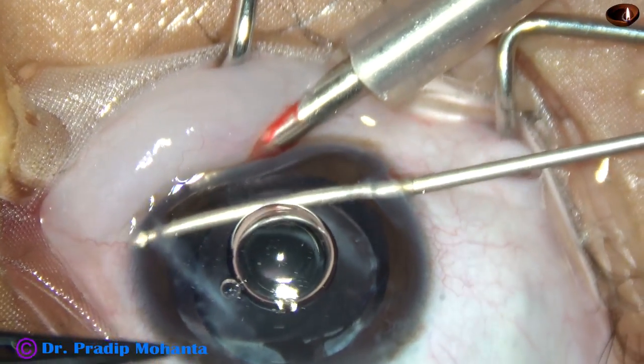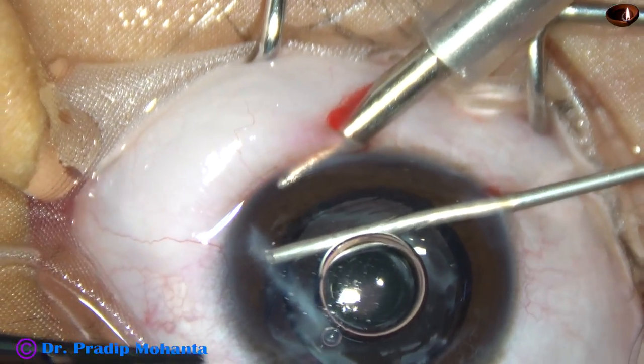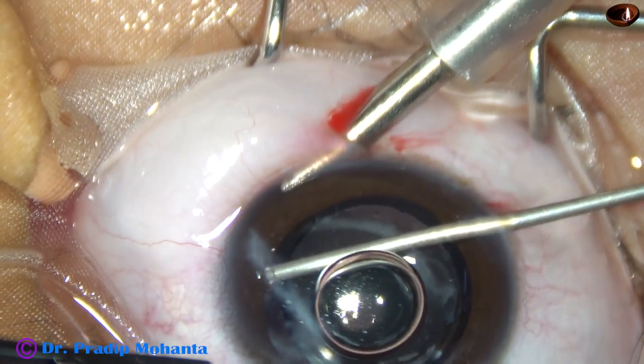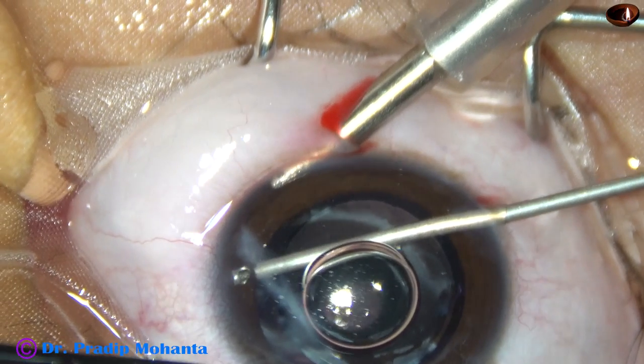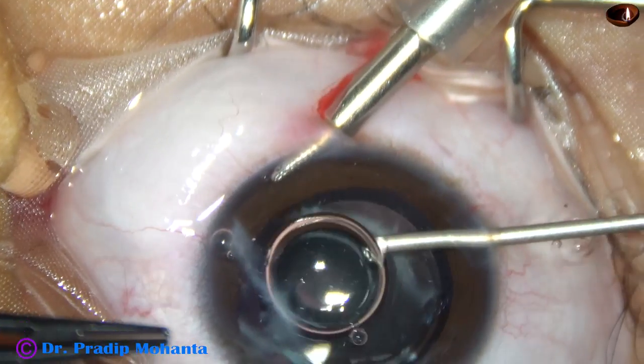Here it is. This is the tissue band of iris joining the scarred area. And here it gets released. The iris has fallen back.